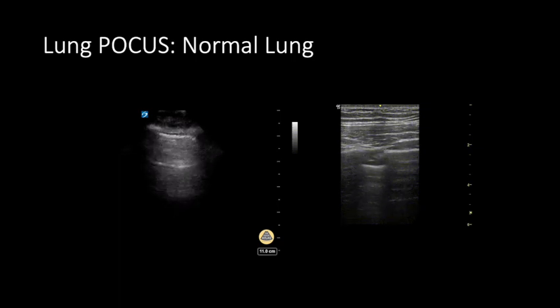Sometimes I've heard this shimmer described as the appearance of small little lines of ants, like I mentioned, that march along the pleural line, and that sort of grainy quality can also be seen in the image that's generated deep to the pleural line. It's imperative that you see this shimmer, or lung sliding, when looking at lung ultrasound before determining if a lung is healthy or not.